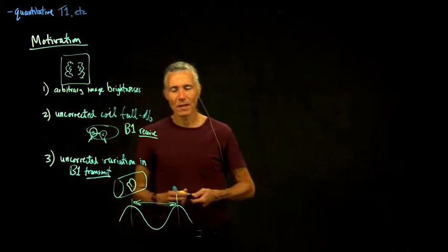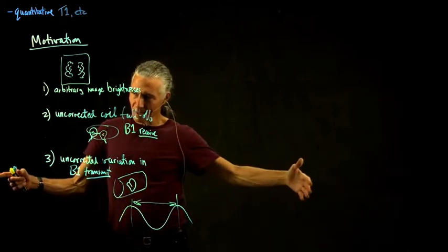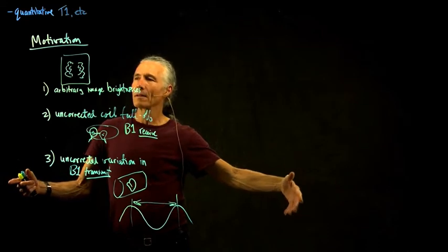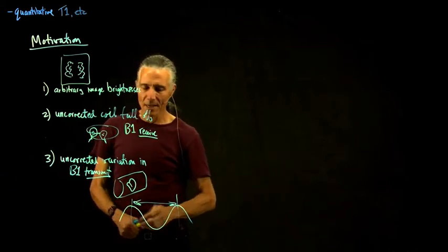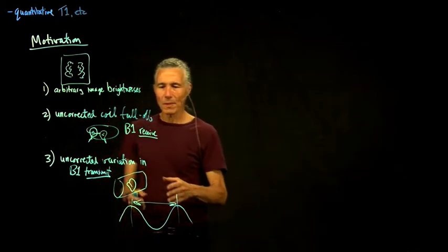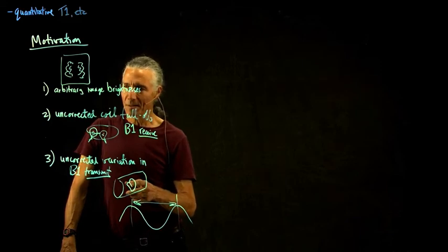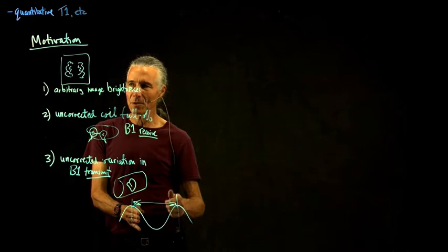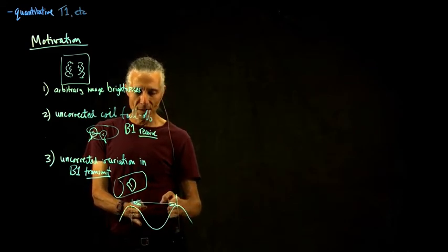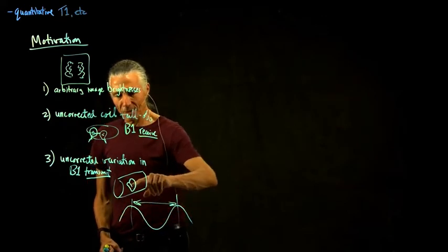If you look at a 1.5 T magnet, the wavelength is a couple of feet, I don't know, 3 feet, something like that, between the wave fronts. So that's big enough compared to the head that the head doesn't affect it as much. But if you turn the Tesla up, which turns the frequency up, which causes the wavelength to get smaller, then it starts to get closer to the size of the head.